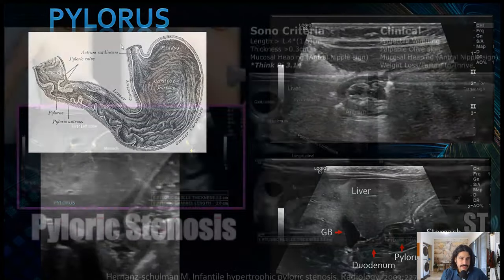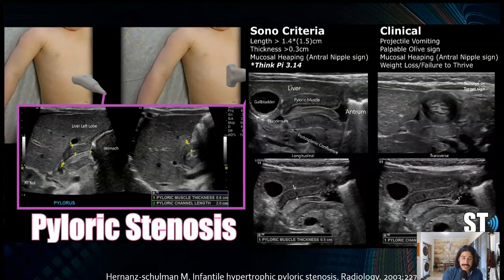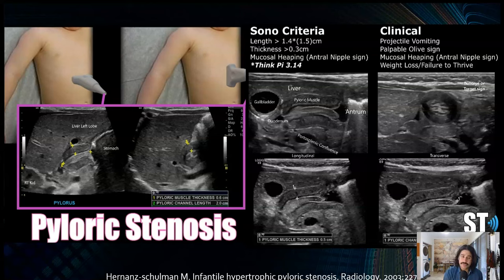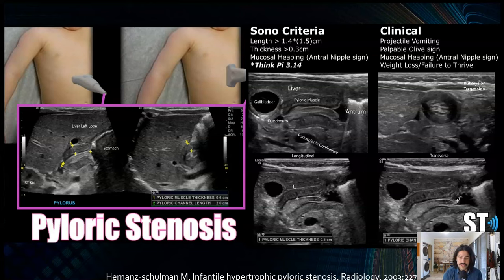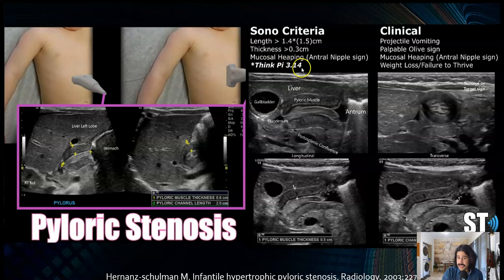Pyloric stenosis is an obstruction caused by hypertrophy of the pyloric muscle — hypertrophic pyloric stenosis. The main symptom is projectile vomiting. Anytime an infant comes to the ER with vomiting, they're always going to order a pyloric ultrasound to rule it out. The criteria for pyloric stenosis is greater than 3 millimeters in thickness and greater than 15 millimeters in length. A mnemonic for this is PI (3.14) — the 3 being the thickness and the 14 being the length. The thickness of the muscle is much more important than the length.